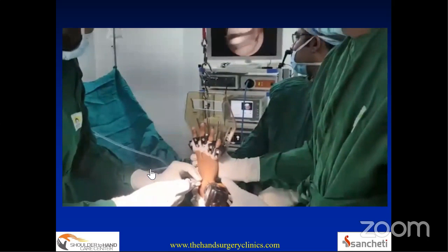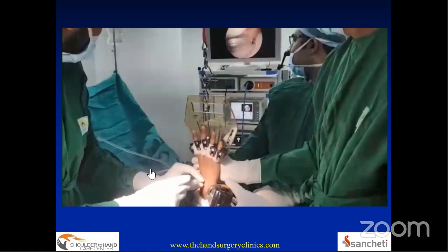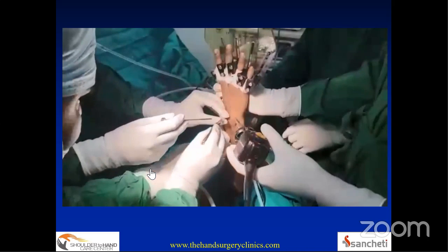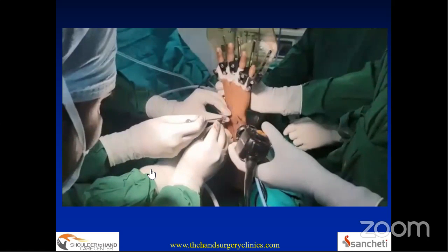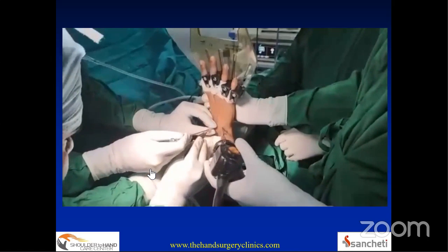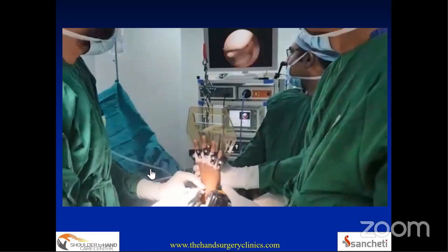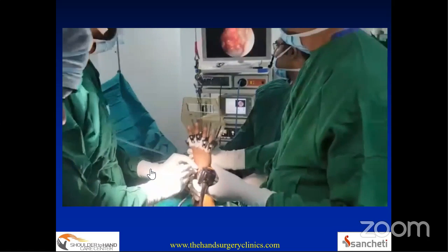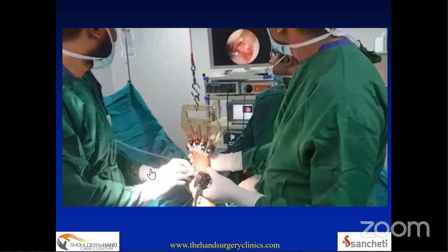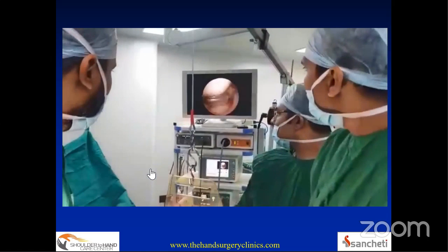My camera and scope are in the ulnar midcarpal portal, whereas the radial midcarpal portal is being used to fill in the gap with morcellized cancellous bone, as you can see here. And we use a small cannula. We usually use the sheath of a hypodermic needle, which is transparent and also is big enough to enter the joint space and the portal.